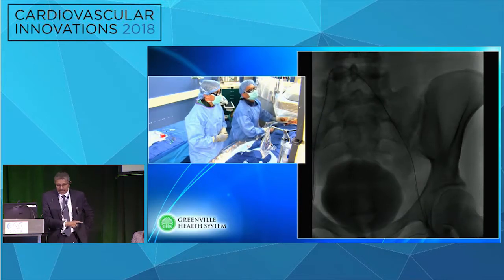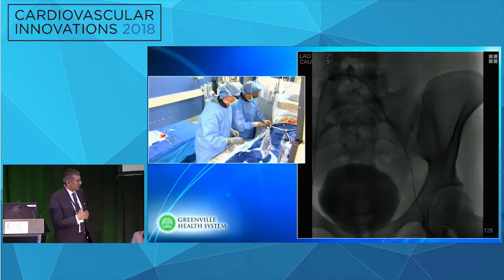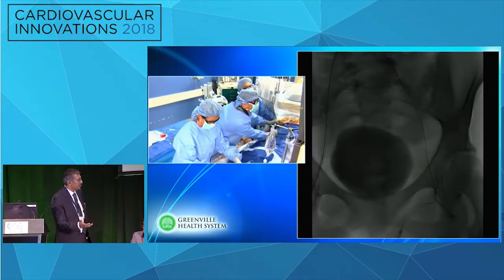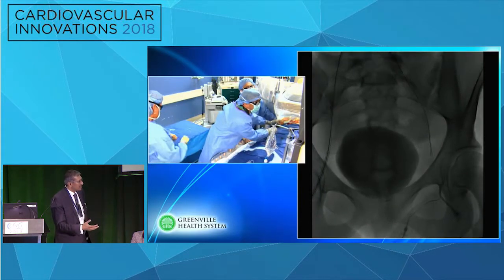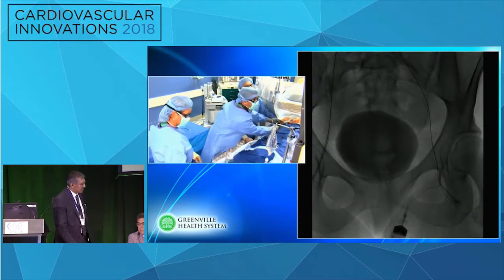Bruce, I'm going to ask our panel a question while you wire this through. For those who are not as experienced, imagine they are going through and they've crossed this proximal iliac occlusion, how would you suggest they actually confirm they're in the right place before they confidently advance their big sheath? Should they do some IVUS? Because now the vein is constricted, you will see the walls. What should they look for? If you inject some contrast, it'll destroy this area, you won't be able to work. So what are the options that are available to operators?